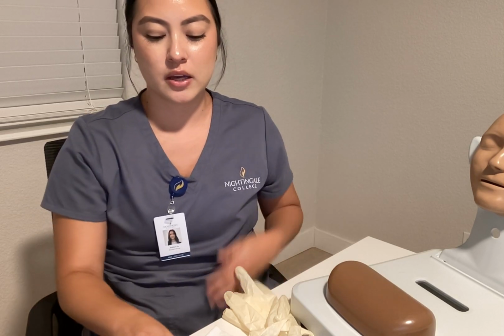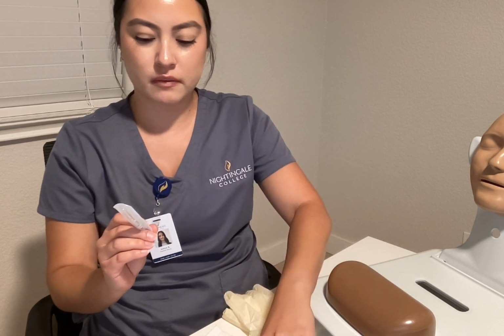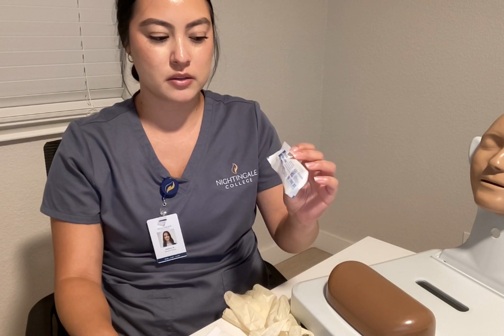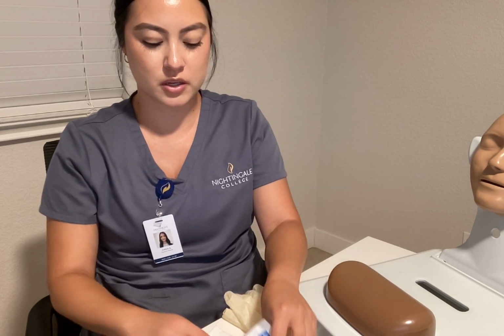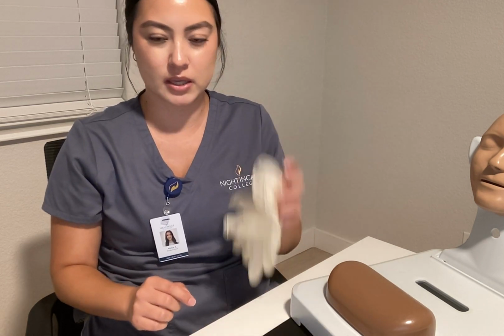Today I'm going to be doing an intramuscular injection. I have my medication here, my needle, which is a 25 gauge by 1 inch, my syringe, which is a 3 ml syringe, alcohol pads and gauze, and my gloves.